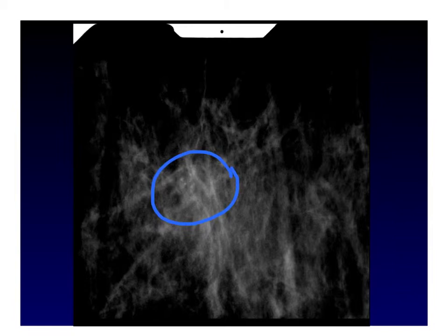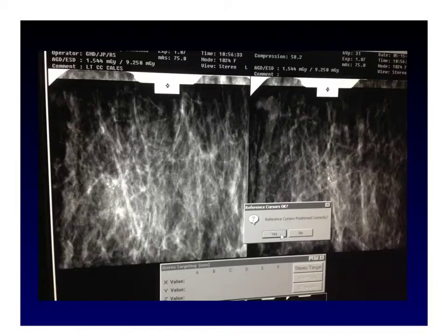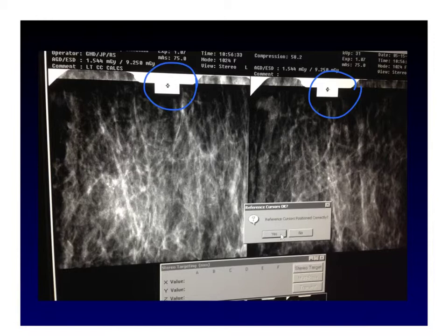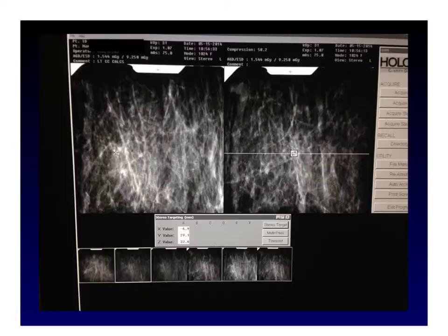We are now ready to take our stereo pair. We move the camera 15 degrees off center in one direction and 15 degrees off center in the other direction to acquire our stereo pair. This enables us to target the calcifications and obtain X, Y, and Z coordinates. First, make sure the reference cursors are positioned correctly — we are telling the computer that X, Y, and Z are zero at this location, which correlates with a real spot on the compression paddle. We then target the calcifications. In our case, the X, Y, and Z coordinates are minus 6.9, 29.1, and 33.6.